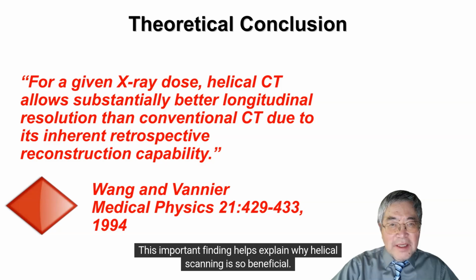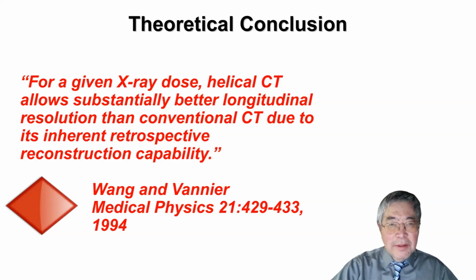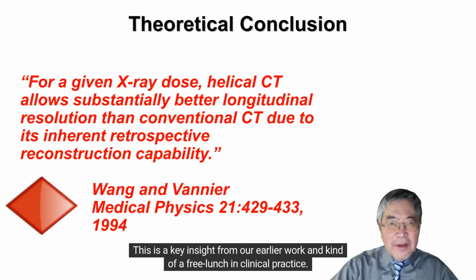This important finding helps explain why helical scanning is so beneficial. Some believe that you gain temporal resolution with helical scanning but lose longitudinal resolution. However, with proper overlapping reconstruction, both temporal and longitudinal resolution can be improved. This is a key insight from our earlier work and kind of a free lunch in clinical practice.